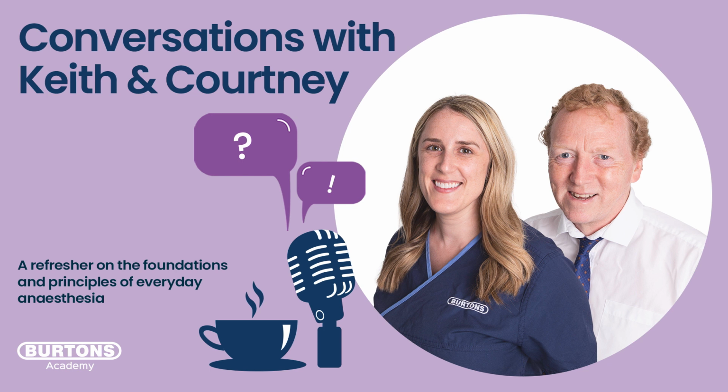And of course, that raises that obvious question. We've worked very hard to get their end tidal CO2 to 40. We worked very hard to take over their spontaneous breathing. So they're now not breathing on their own. We're breathing on the ventilator. The orthopedic surgeon has finished. They've walked away. And the animal now needs to wake up. But it has no spontaneous drive. So how do we wake it up? And I think this is another cause of concern for people who aren't familiar with ventilation. But fortunately, it's quite simple.